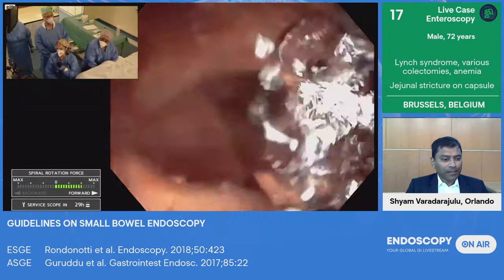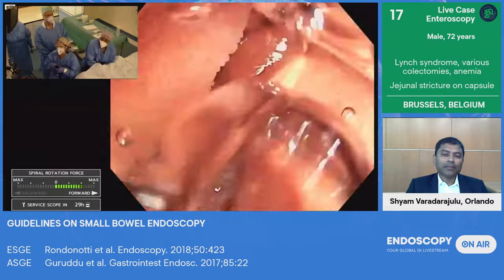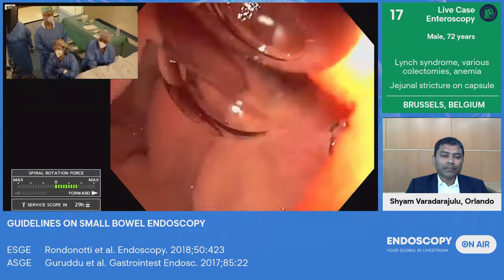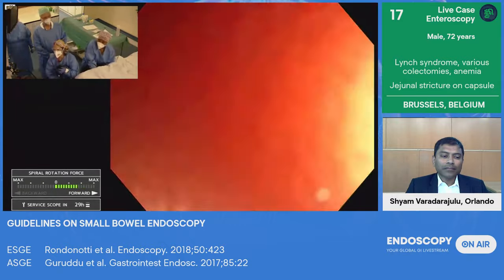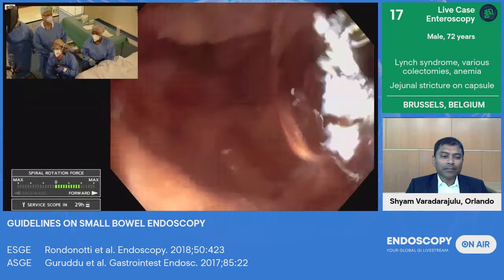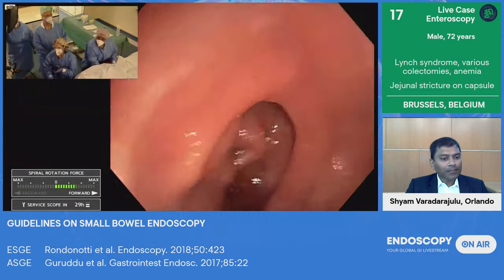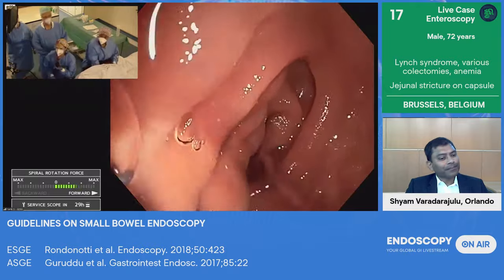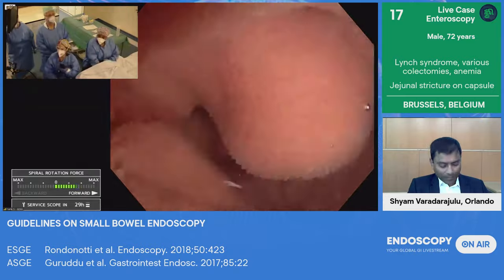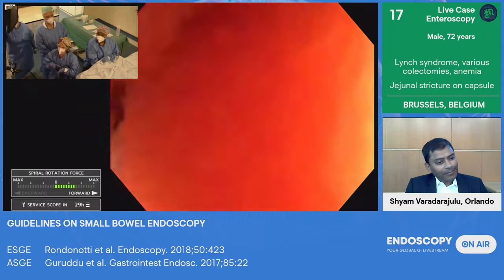Here it also shows that sometimes the capsule can be misleading on the timings and your estimation of whether it's in the proximal or mid-jejunum. Here we had it 30 minutes after the passage of the pylorus, but we didn't have the cecum. So it's difficult to estimate relative to the whole length of the small bowel. Fair enough. We've progressed quite nicely here, but we haven't still seen something. Over the last 2 minutes, it didn't progress so much.